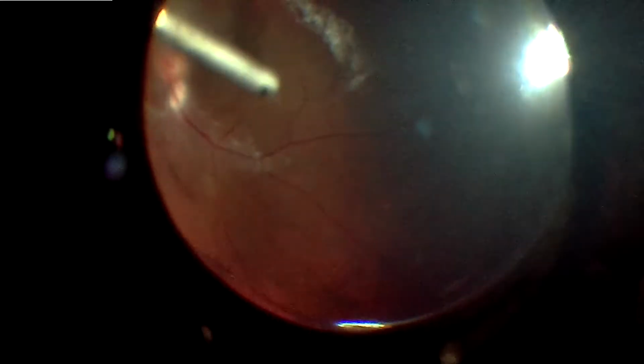So one of the dyes, which is brilliant blue dye, is instilled after exchanging the fluid with air, so that the dye is in good contact with the retina. Once the dye has stained the internal limiting membrane, one starts peeling it after creating a flap. So here we can see a flap has been created and the ILM peel has started.